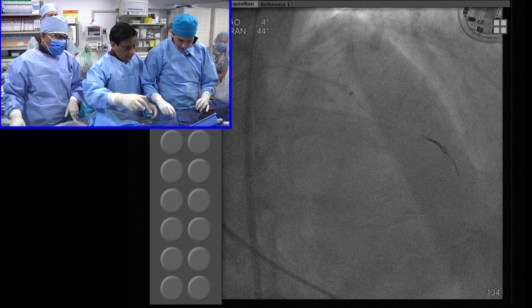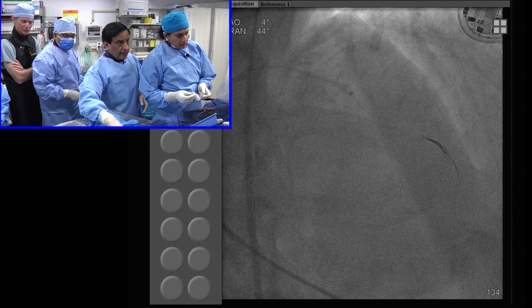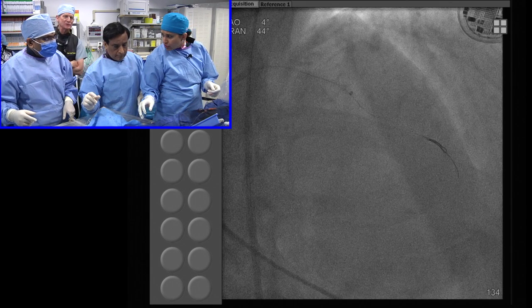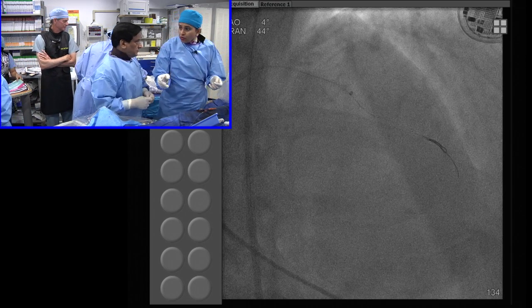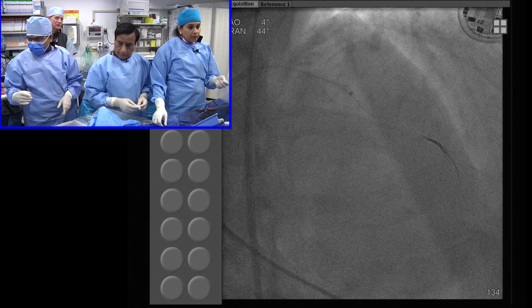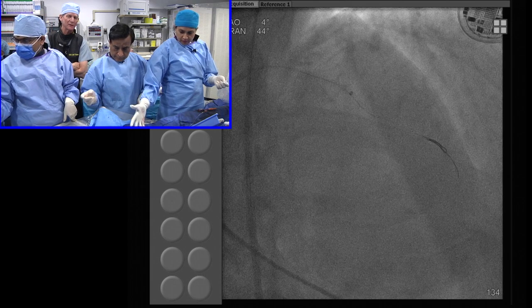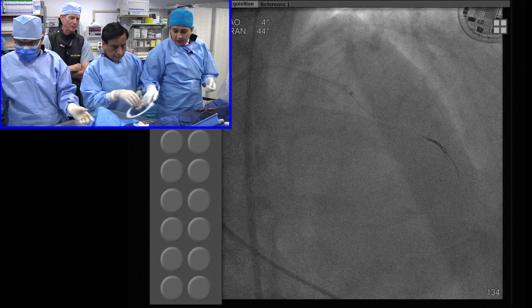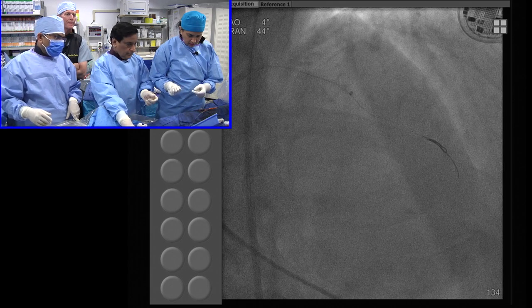Chuck, any advancements coming from Abbott Vascular on BVS, and the Xience family? Get me the balloon again. Yes, so the next generation Xience will be coming out in about a year. Get a new 2.5. There will be a slight change in the stent design, but a very significant change in the underlying balloon delivery system. Most of deliverability has to do with the underlying balloon delivery system more than the stent, actually, from an engineering standpoint. And so, yes, you'll be seeing the next gen Xience just continuing to improve deliverability. Exactly.